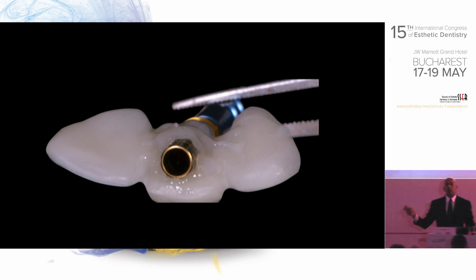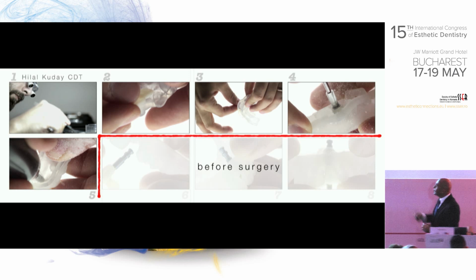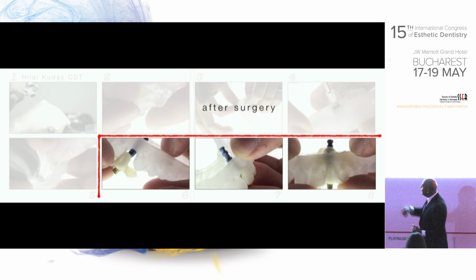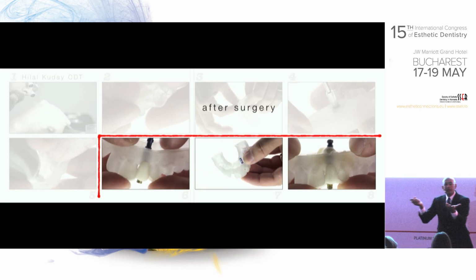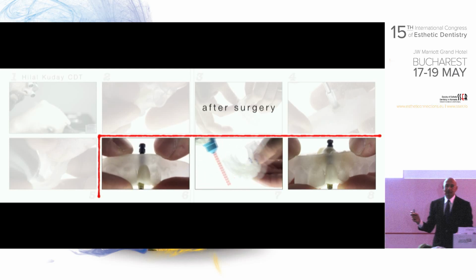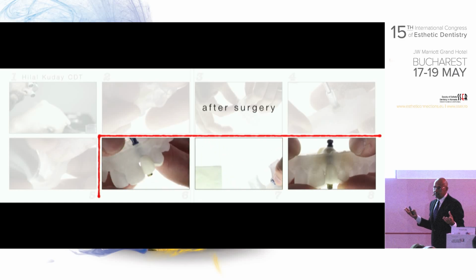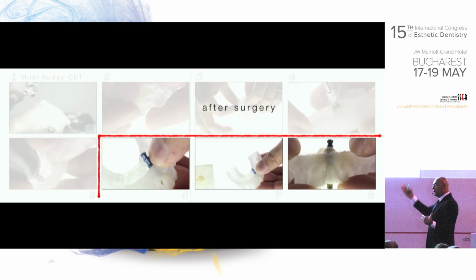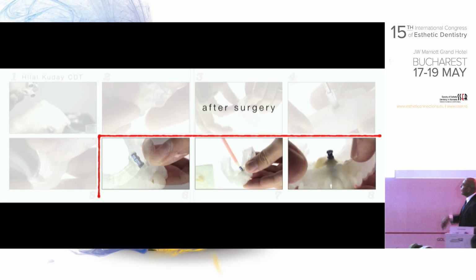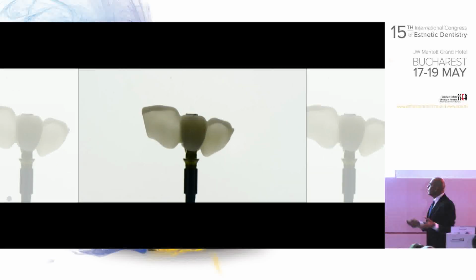So this is what I get. Now, what do I get here on top of this in the laboratory is that since I have this hole prepared in advance, when I seat this Maryland on the teeth in the model, I'm exactly where the implant is. Technically, I don't even need to make a final impression, which I will, but technically you can proceed like this. So you fix it on the inside of the model and work with whatever design you want. Pink, white, you decide.